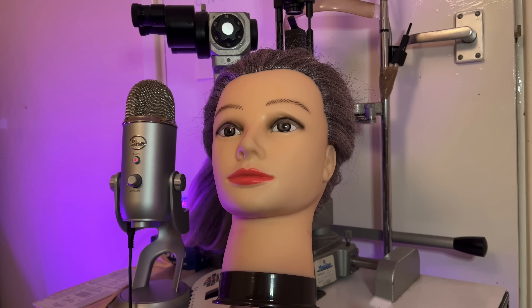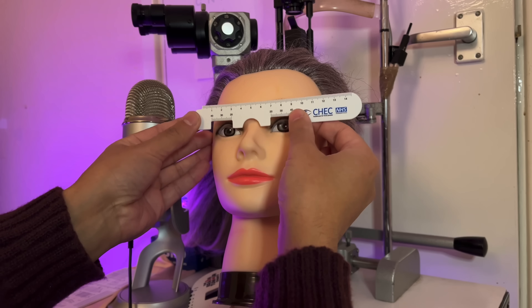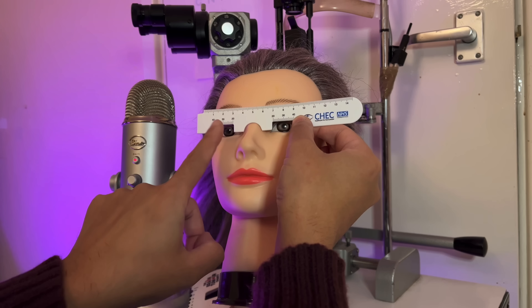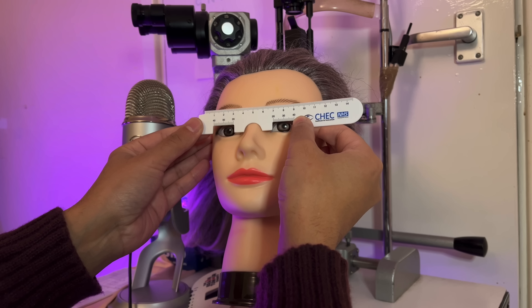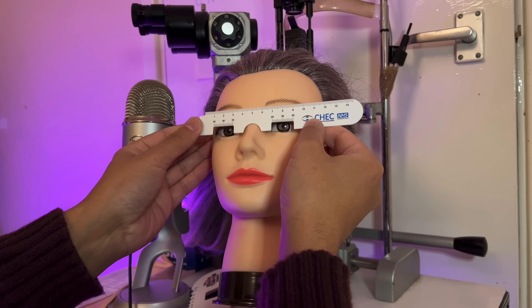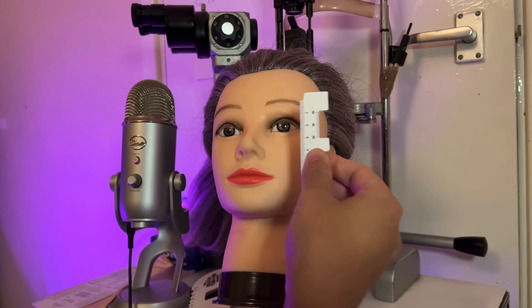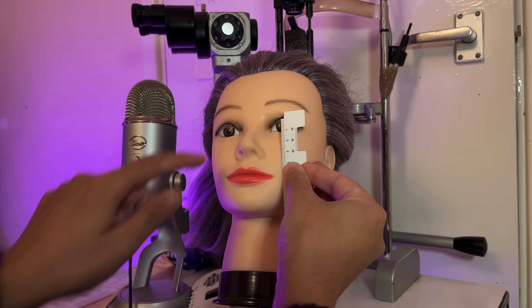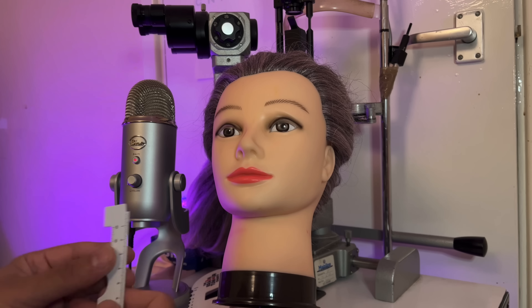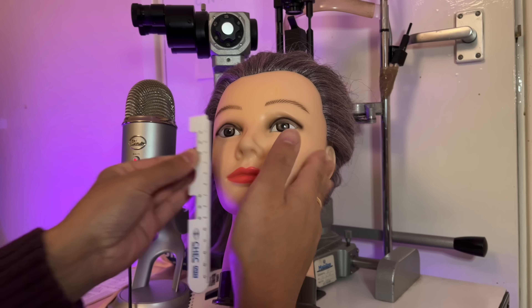Let's move on to some pupil distance measurements. I'm going to do the monocular one using this scale here — place that on the bridge of the nose, keep it very steady, lining up with the center of the pupil, and do the same on this side. Use two hands if it helps. The patient must keep steady looking off into the distance. Then use the vertical part to measure the vertical aperture — that is the lower lid margin to the upper lid margin — which is about nine millimeters.